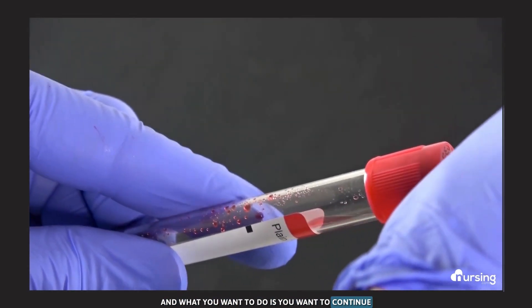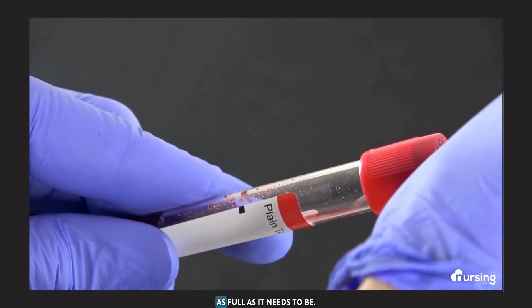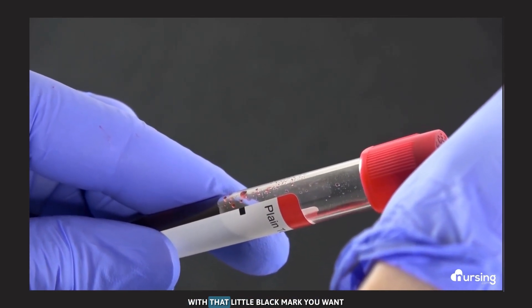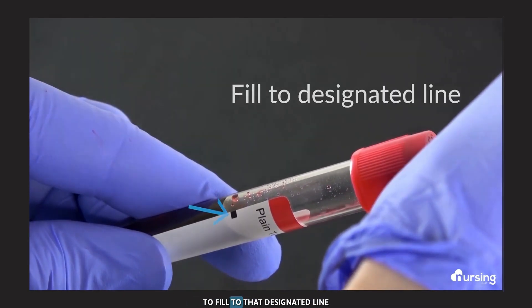Continue filling that blood tube all the way up as full as it needs to be. This is indicated on the label with a little black mark — you want to fill to that designated line.